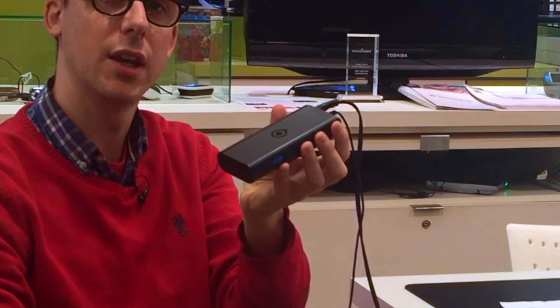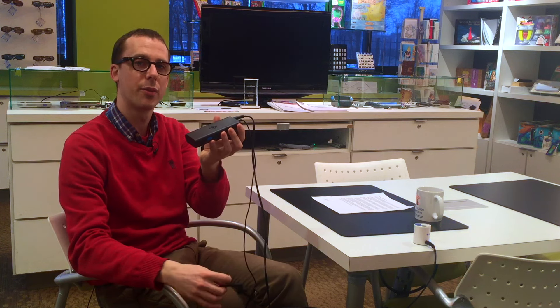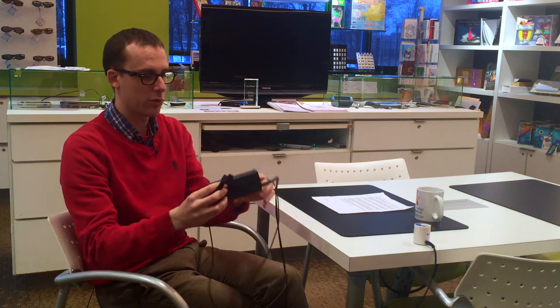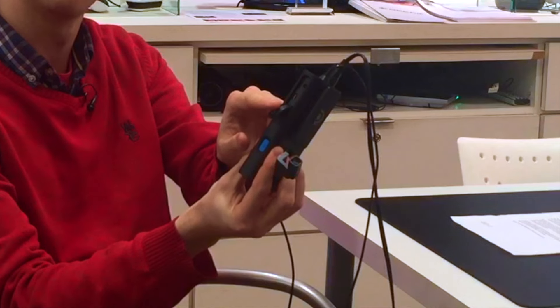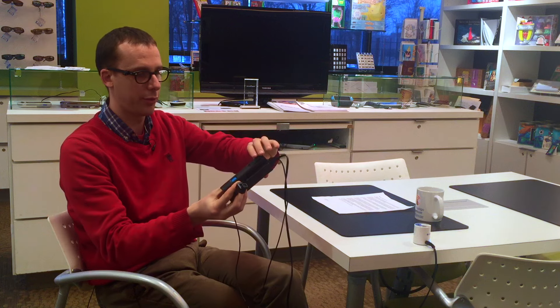The actual device is very compact. It consists of two parts: the camera and speaker, and the control panel. The control panel has a rechargeable battery so it can run away from power, and it also has a computer inside doing the image processing. When it runs out of battery, we can charge it by opening a rubber flap on the side where there's a charging port, just like a cell phone.